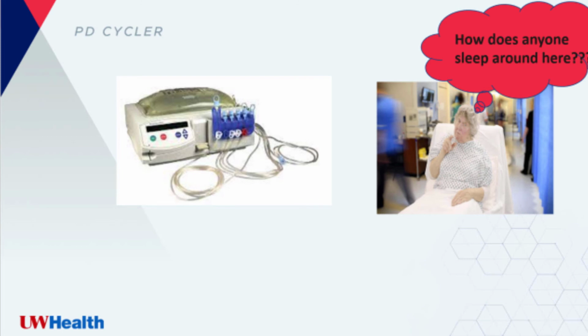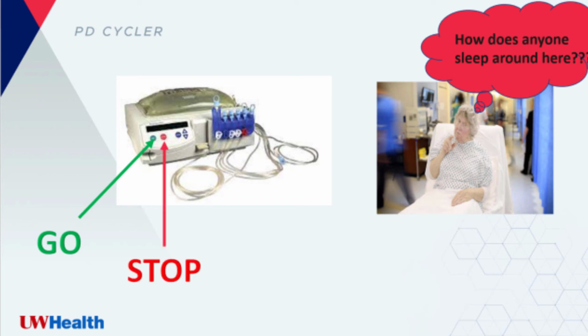This is a cycler used at Meriter Hospital. It is the Baxter Home Choice Pro. The interface is simple to operate and consists of only 5 buttons. The green Go button starts and resumes treatment. The red Stop button mutes alarms and pauses therapy. The blue Enter button is for selecting choice and entering menus. Please note the alarm and press the Stop to silence, then notify the dialysis nurse at 0029.